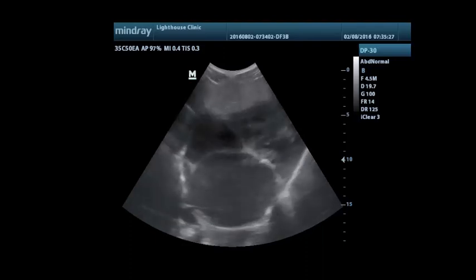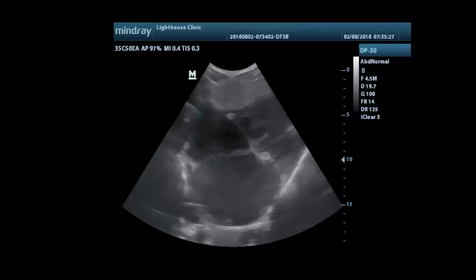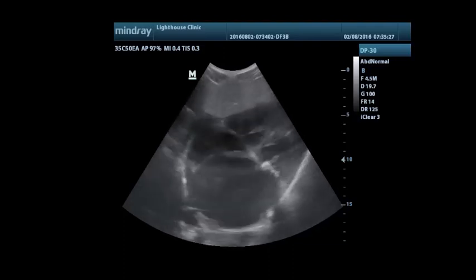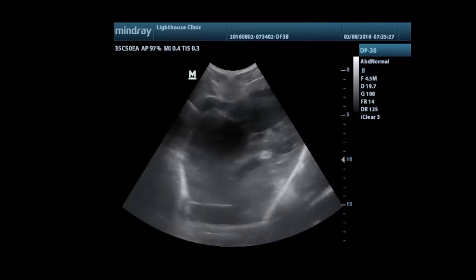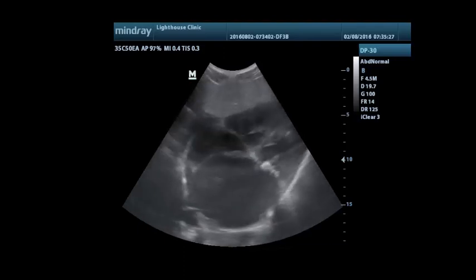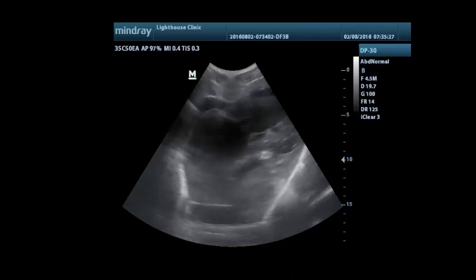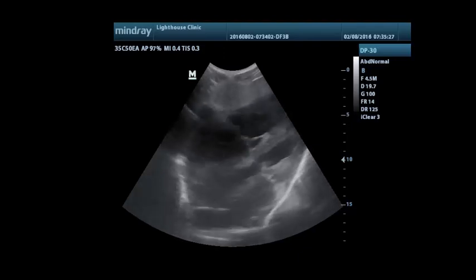And in our setting, most of the valvular problems in the heart are not due to degenerative valvular disease like they are in Europe or in the US, but they are mostly problems of infections, either of endocarditis directly, or, as in this case and more commonly, as a post-infectious complication, the post-rheumatic heart disease. And that is what we are looking at here.